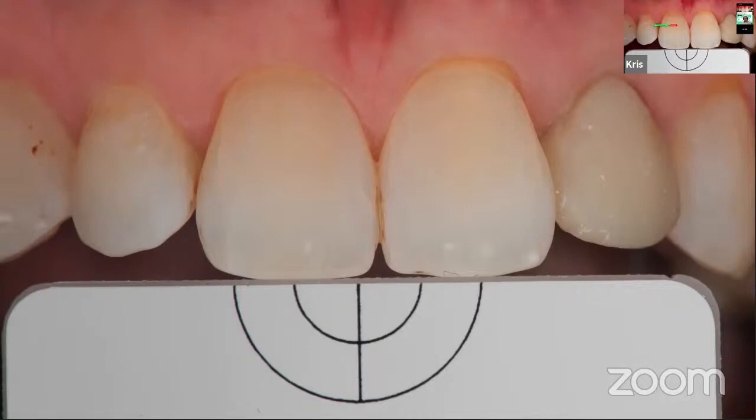We take pictures with cross-polarized photography, and using the software from ELAP from Sasha Hein, we are measuring and correcting, trying to have the correct mixture of the dentin colors, to have the foundation for building the ceramic crown.